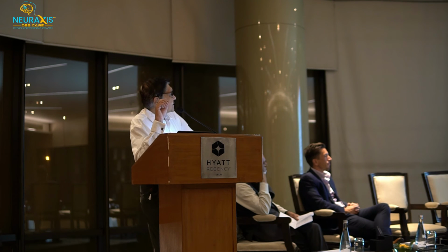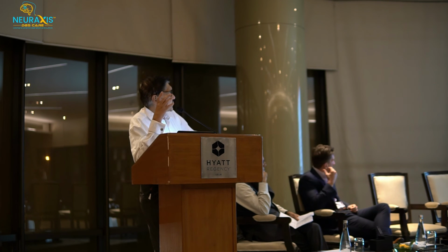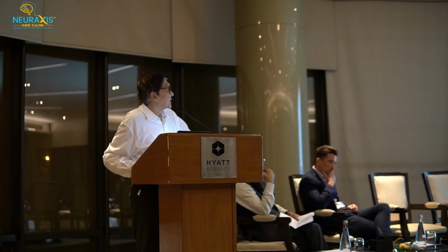So I conclude by saying that DBS is a proven therapy for patients suffering from Parkinson's disease, essential tremor, dystonia, Tourette syndrome and epilepsy. We are also trying now to use it for other disorders like depression, OCD, addiction and Alzheimer's disease. This is an upcoming specialty. It's an exciting technology. There is continuous improvement. New nuclei are being identified. New indications are also being identified.